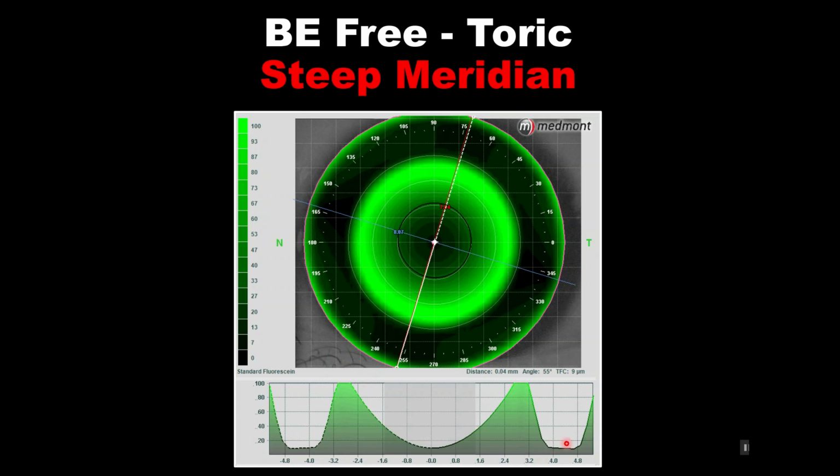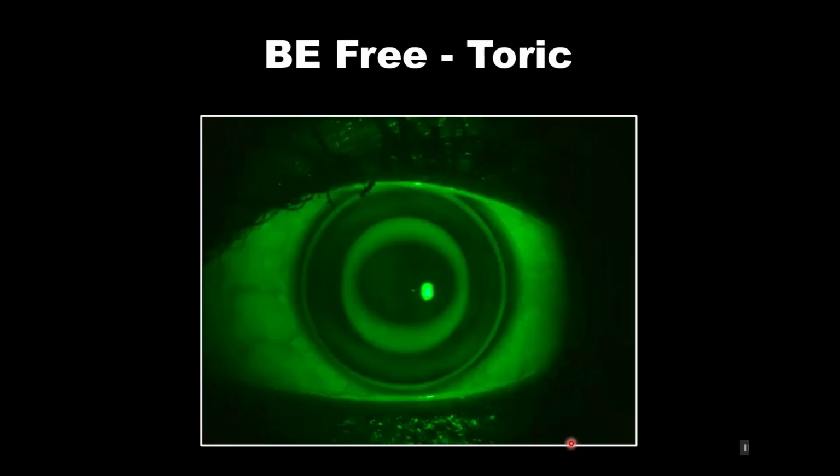Just a tiny fluid layer to allow for a good healthy tear pump and the appropriate lens to cornea relationship that would promote centration, comfort, and the hydraulic force that we want to achieve the myopic reduction as well as the astigmatic reduction.